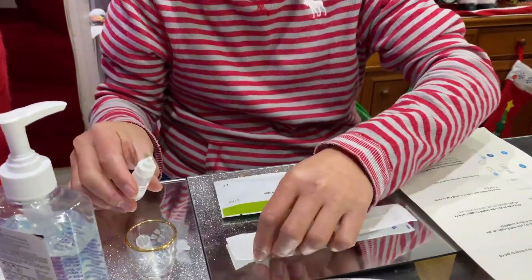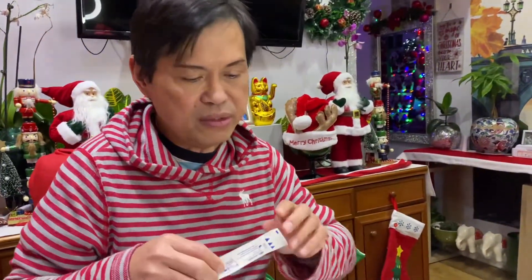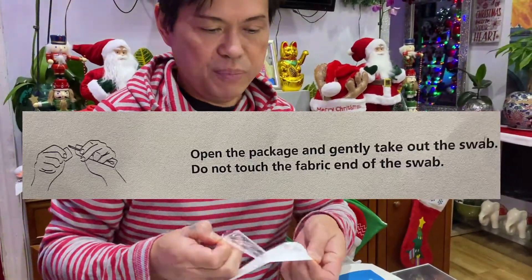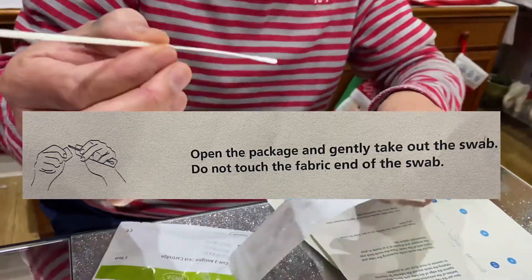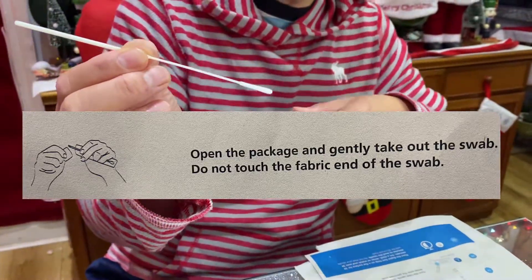Close the buffer bottle. Get your swab, open the package, and gently take out the swab. Do not touch the fabric tip — the soft end — you must not touch it.